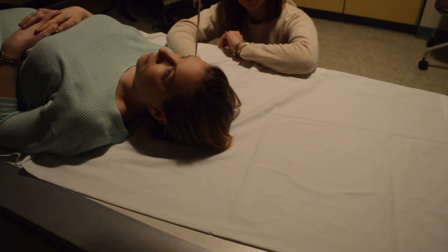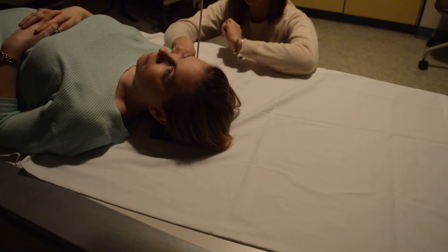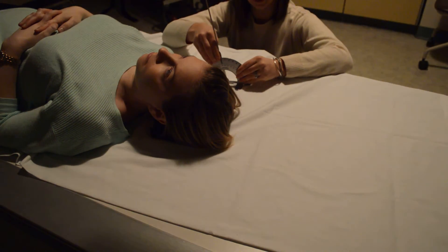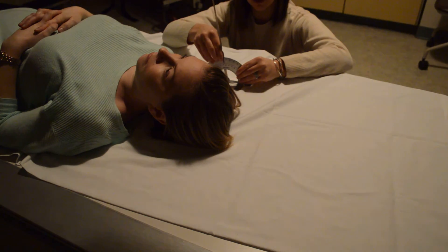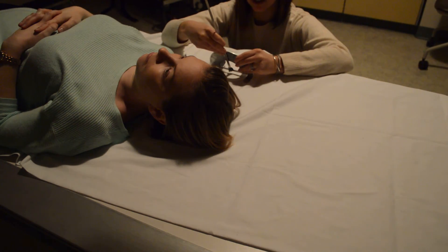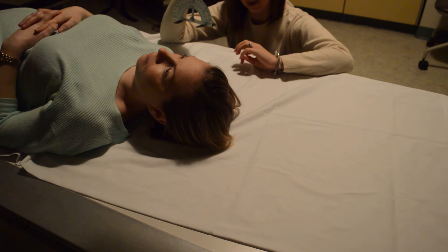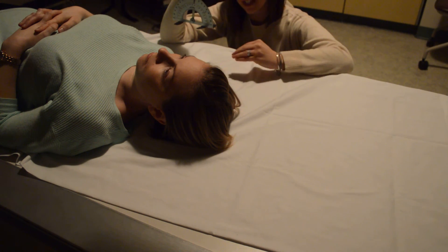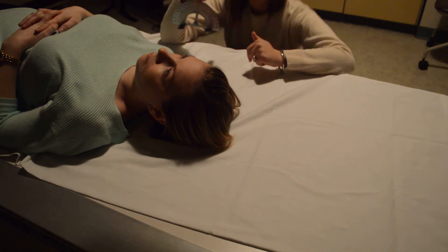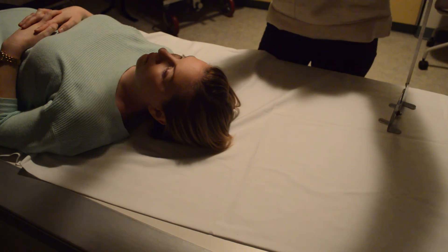Right now she's measuring 10 degrees caudal. I teach students a little trick: if I take 10 degrees caudal and go 15 degrees cephalic to it — follow that on your angle liners — I'm going to end up with a 5 degree cephalic tube tilt to be 15 degrees cephalic to a 10 degree caudal OML. So I want 5 degrees cephalic.